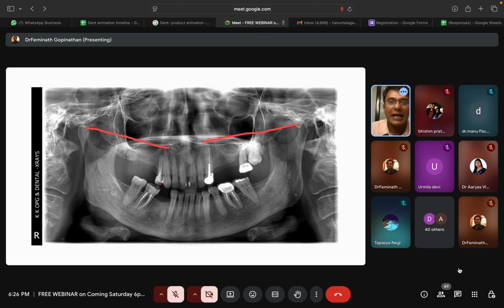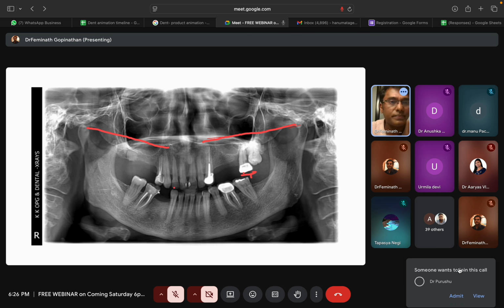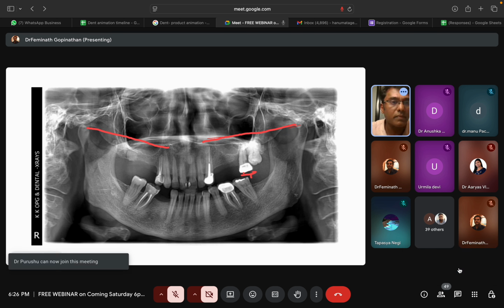Now, OPG is when you have your lower jaw opened slightly. So that means you have this mandible, in the lower jaw, this molar will be slightly more anteriorly placed in the OPG. In reality, this will be somewhere here. So you can understand that this plane is a stable plane. That is, now you try to draw. Now you just try to draw like this.